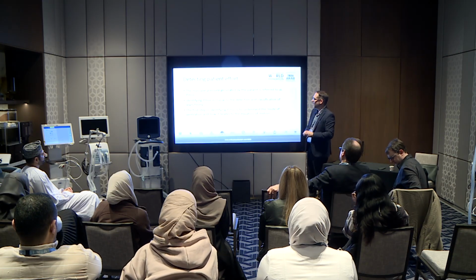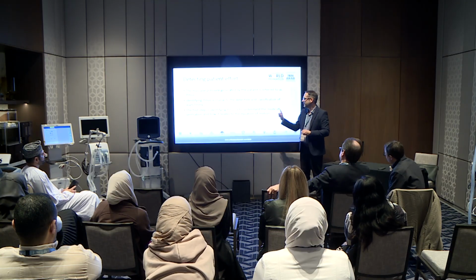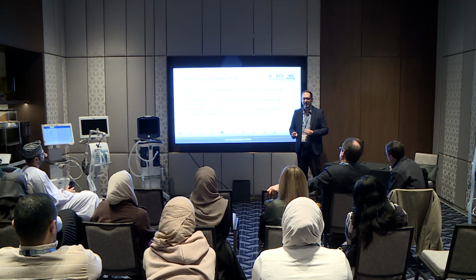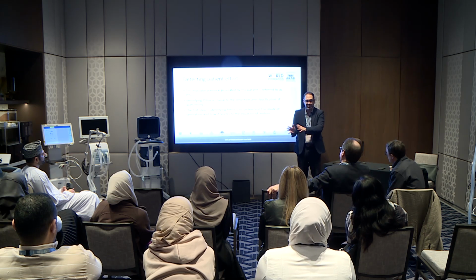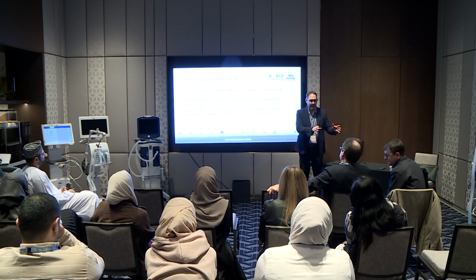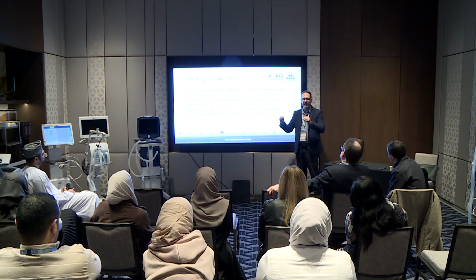If they did, whatever you see after that is not reverse triggering because the patient triggered the ventilator. Identifying PMUS has to do with understanding the equation of motion. Remember, if it's volume control, what's going to change? Pressure. If it's pressure control, what's going to change? Flow and volume. So where you look depends on the mode, and that's how you identify asynchronies.